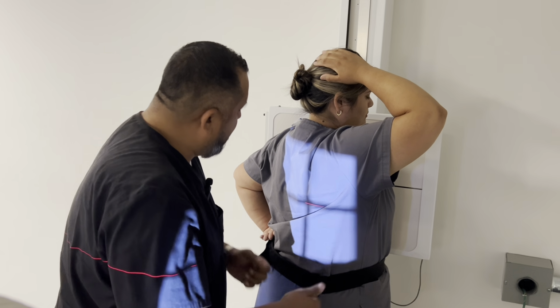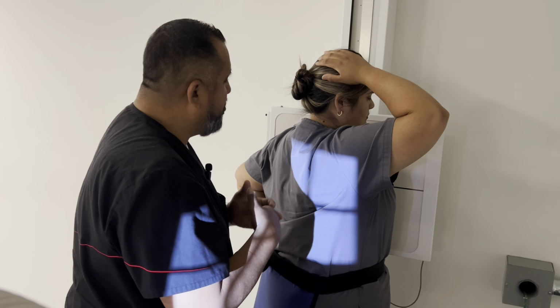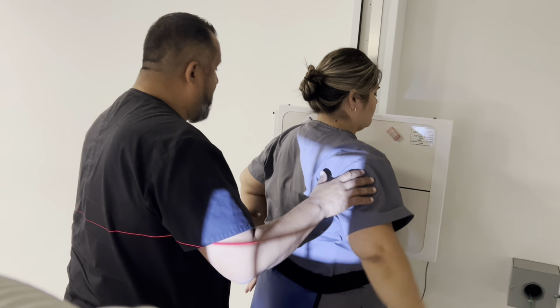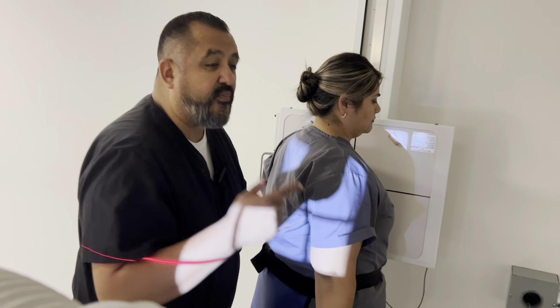Okay, so again, go ahead and breathe in, let it out. Breathe in again and hold it, x-ray clear, you can relax. Okay, now you can go ahead and put your arms down. If you want to do AP obliques, that's going to be LPO, RPO position.